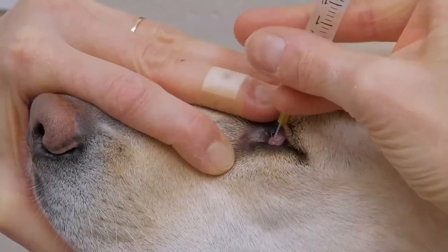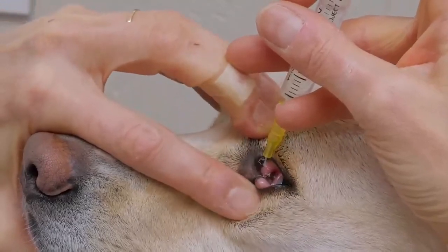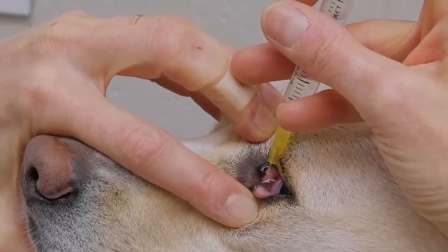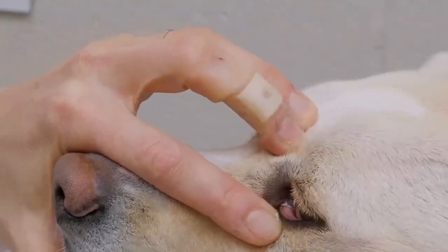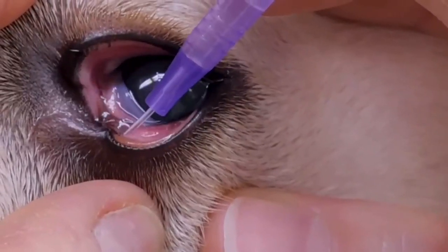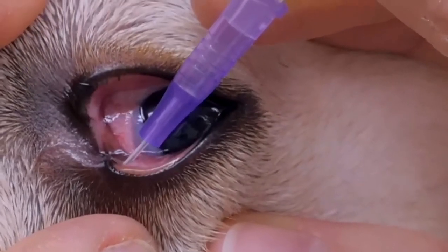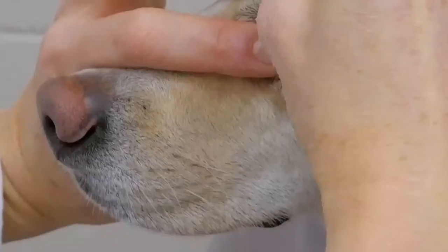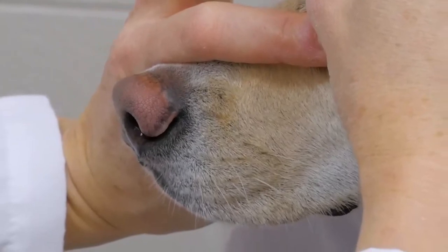The catheter is passed into the upper and lower lacrimal puncta in a medial direction, and with gentle pressure, the puncta are flushed. To prevent kinking of the catheter, it is important that the eyelids remain taut and that the cannula is parallel to the canaliculus. In a normal animal, fluid should emerge from the opposite punctum and out the ipsilateral nostril. Some normal dogs will elicit a prompt swallowing reflex, which indicates patency to the nasopharynx.